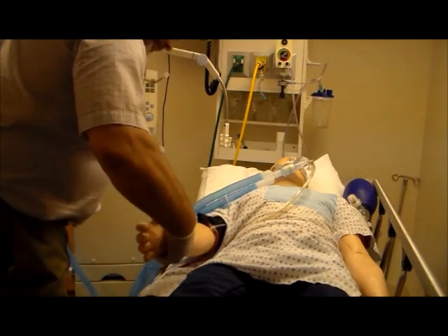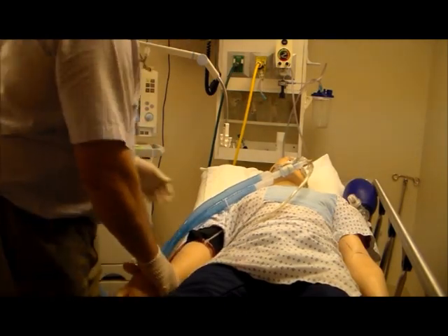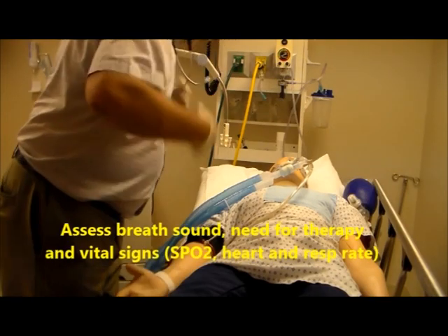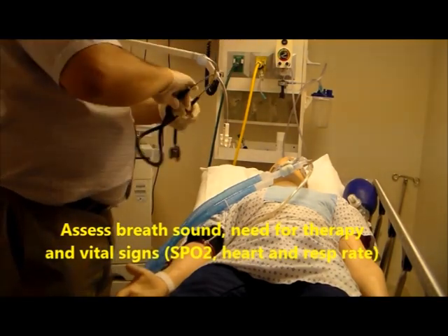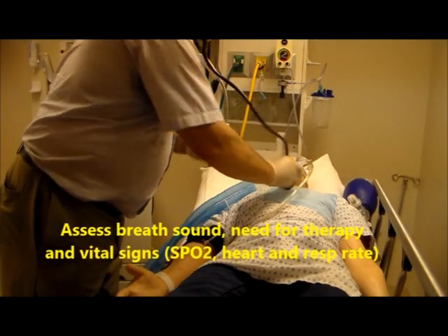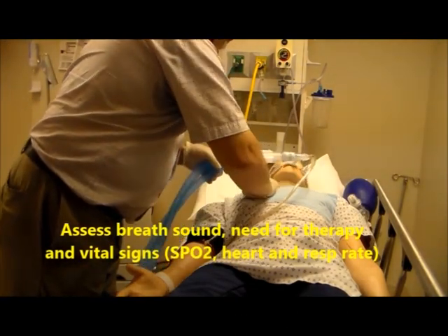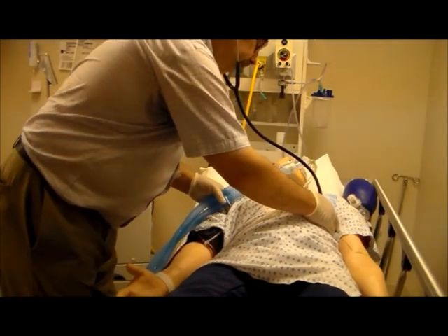Hello Mr. Smith, how are you doing today? You then want to assess for the need for the treatment as well as vital signs. This would include breath sounds, heart rate, SpO2, and respiratory rate.